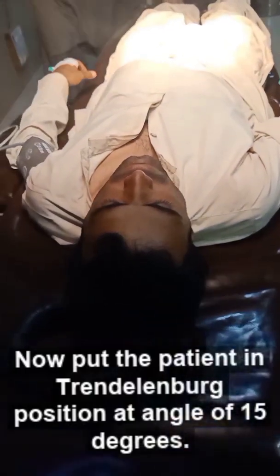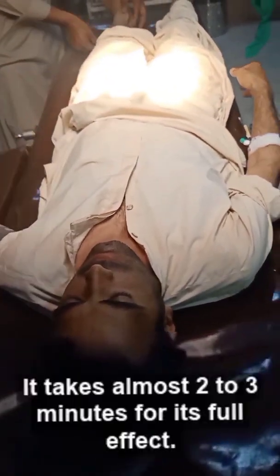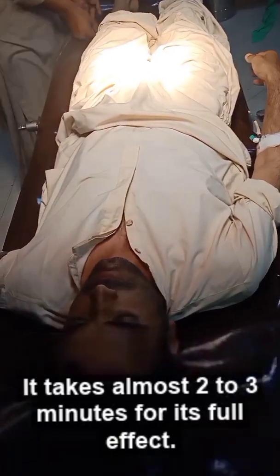Now put the patient in Trendelenburg position at an angle of 15 degrees. It takes almost 2 to 3 minutes for its full effect.